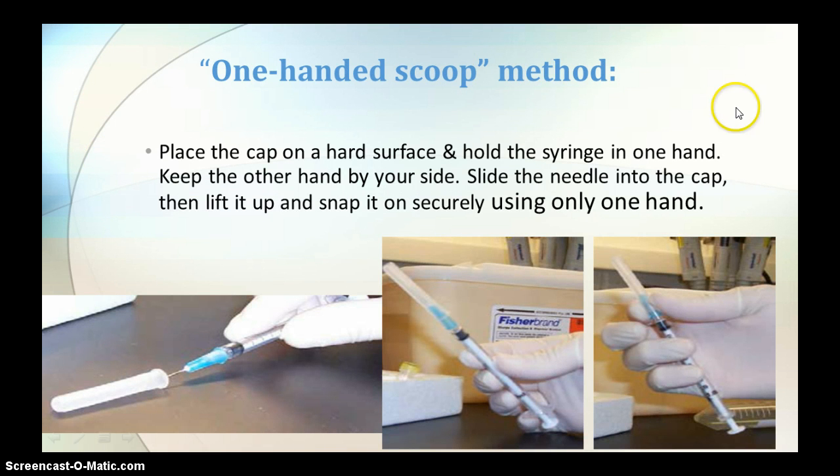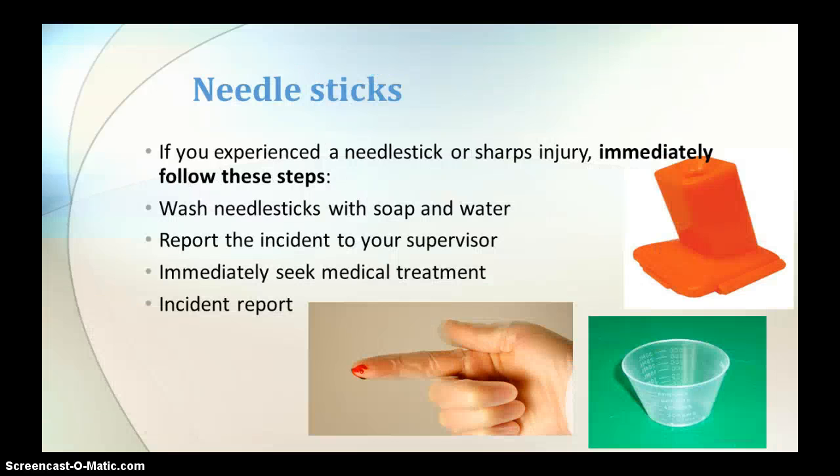There is a one-handed scoop method. We don't use it too often, but if you do need to recap a needle, usually it's a sterile needle after you've drawn up some medication. You must do it one-handed, and this is one way we will practice in the lab.